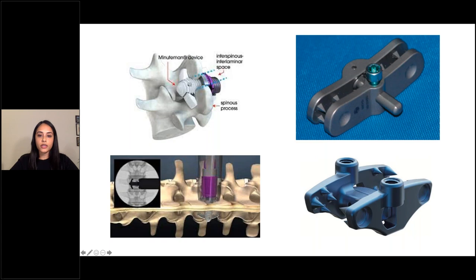At the top right is the Spire spinal system by Medtronic that can be placed by spine surgeons for posterior stabilization as a supplement to another fusion method, such as interbody fusion. It's indicated for degenerative disc disease, spondylolisthesis, spinal stenosis, scoliosis, or other spinal curvatures. And at the bottom right here, we have the InSpan device. It has two plates with staggered spikes and an interlocking hub. It's approved for similar indications in the non-cervical spine.